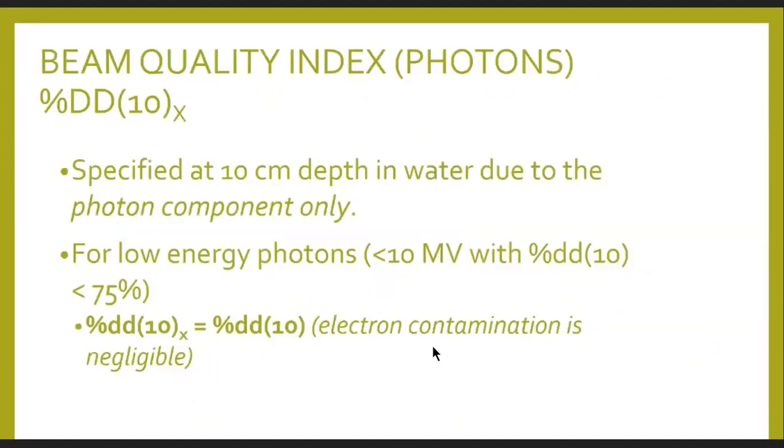So how do we determine KQ? It's not possible to calculate all of these factors while doing reference dosimetry.